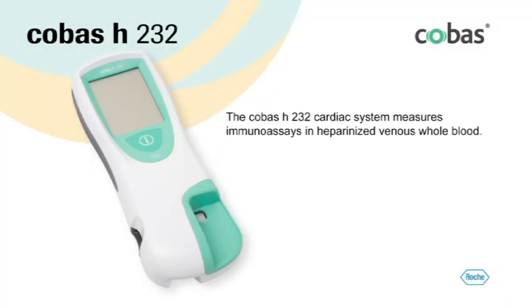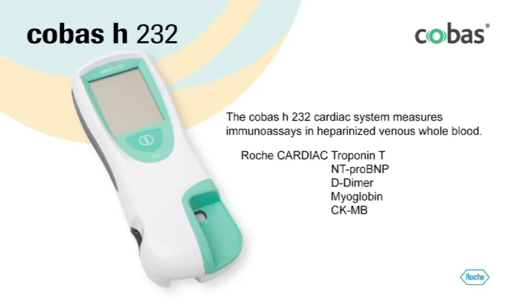The portable Cobas H232 cardiac system by Roche measures immunoassays in heparinized venous whole blood. This program will focus on using the Roche cardiac troponin T test strip. The Cobas H232 system can also be used to perform NT-proBNP, D-dimer, myoglobin, and CKMB tests following the same steps outlined in this program. Note that some tests may not be available in all countries.